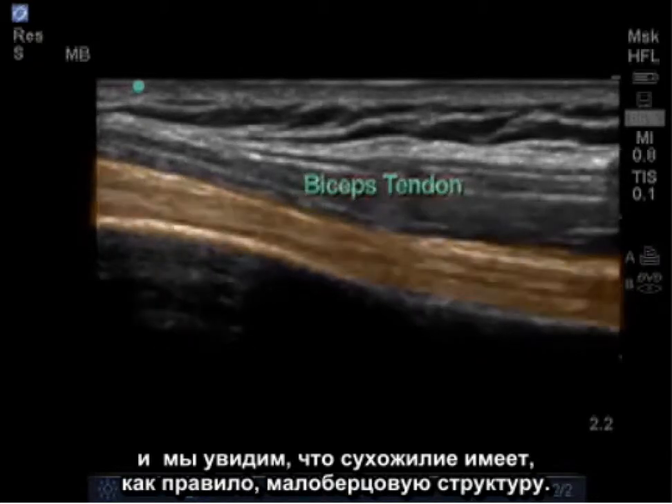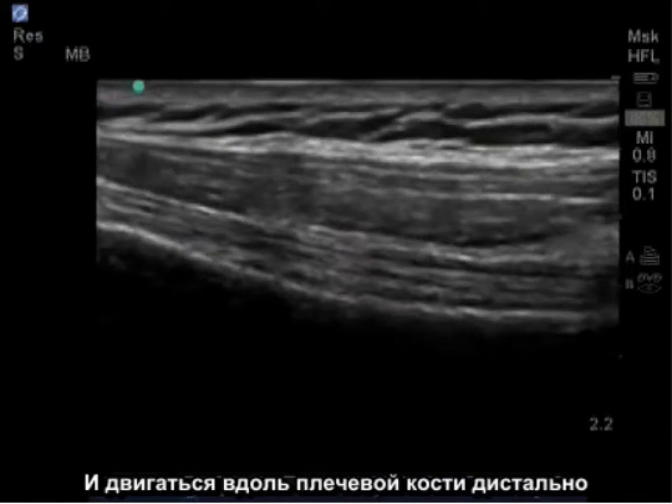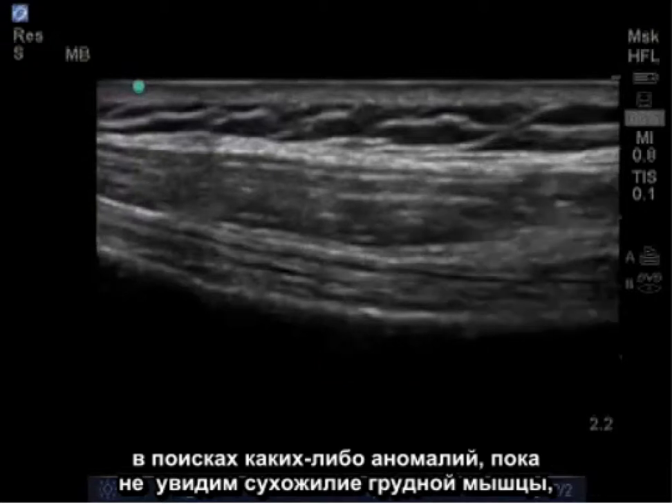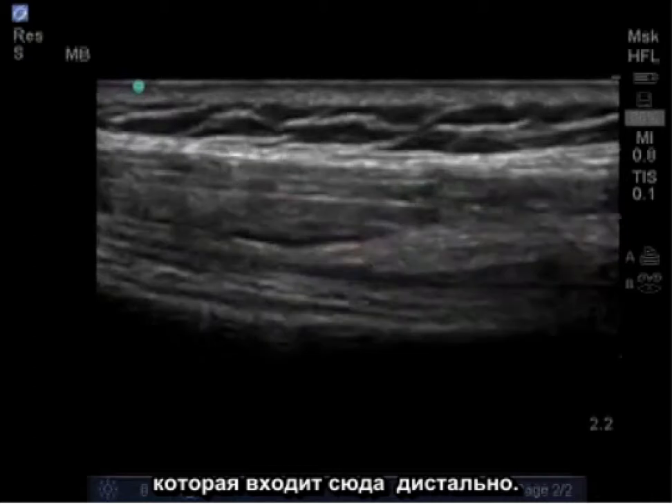A tendon tends to have a fibrillar pattern, and we can follow this tendon as it runs along the humerus distally, looking for any abnormalities, until we begin to see the pectoralis tendon coming in and inserting here distally.